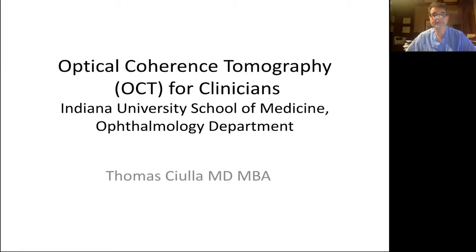How can we differentiate between polypoidal choroidal vasculopathy and central serous retinopathy on OCT? That's an excellent question. Polypoidal choroidal vasculopathy will have, if you're able to scan through a lesion, that inverted U sign that I showed you, whereas central serous retinopathy typically just has subretinal fluid. As I mentioned, there is a free download of a paper we just wrote. It was actually a clinical case series of OCTs. And we go into this in more detail, so that's available for your reference, which has more detailed explanations than what I can do here live.